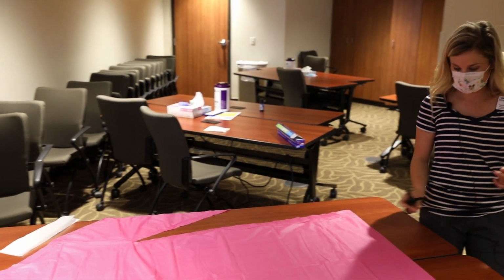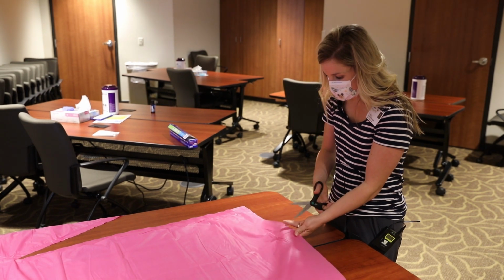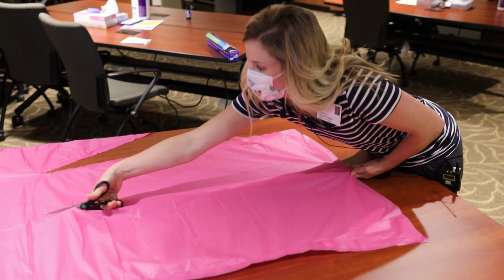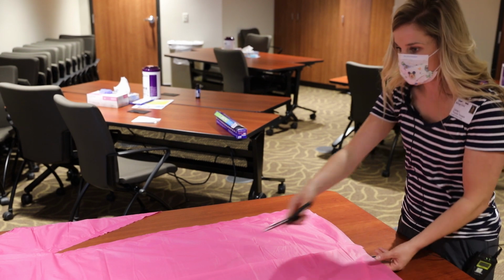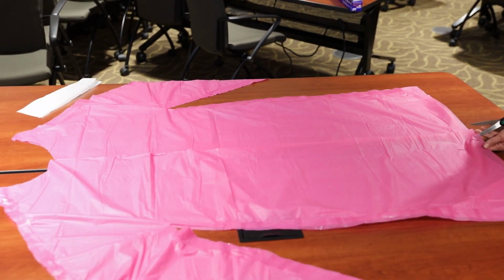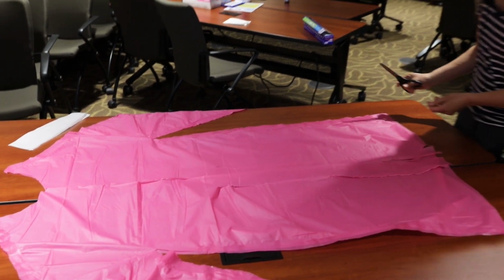And then after you're completed sealing the sides together, we're going to work on cutting the gown so you can actually wear it. So the first thing you're going to do is make a nice long slit up the back of the gown. And then you're going to need to create two ties. And we have found that it's typically about 8 inches from the armpit that works best. And then lastly, you'll need two thumb holes.